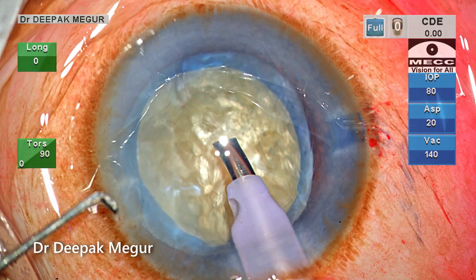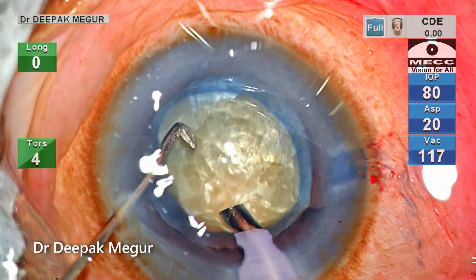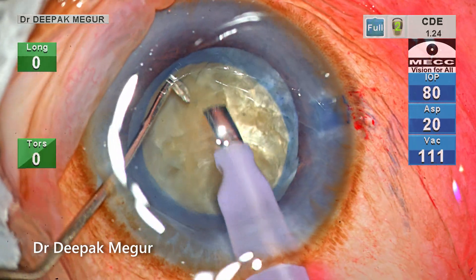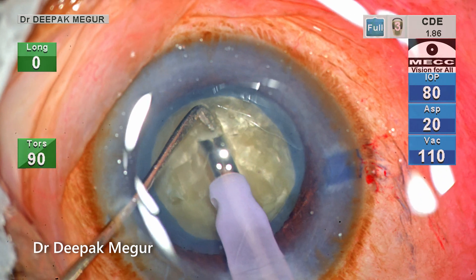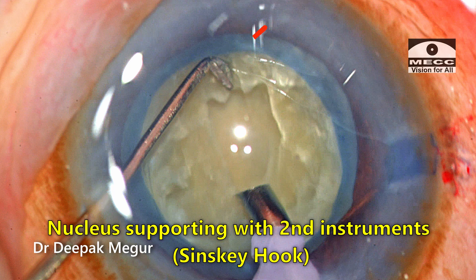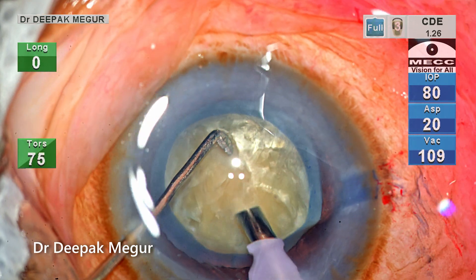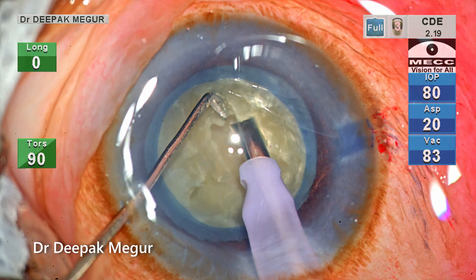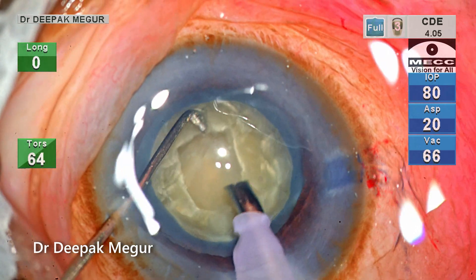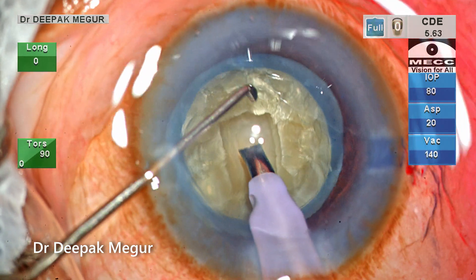Surprisingly the nucleus seems quite bulky and dense. Before doing a direct chop, I want to create a small trench so that I can bury my phaco tip into the heart of the nucleus. When trenching, I support the nucleus with my second instrument so that the trenching becomes effortless — nucleus stabilization helps in getting a better purchase with each stroke of the phaco tip. Once I have adequate depth, I decide to proceed to chopping.